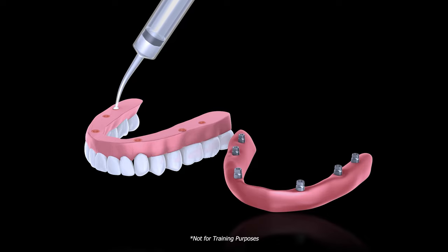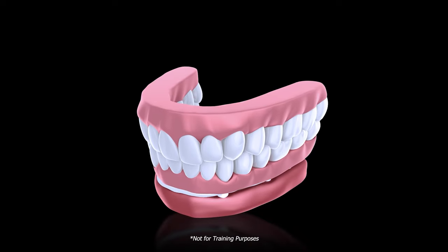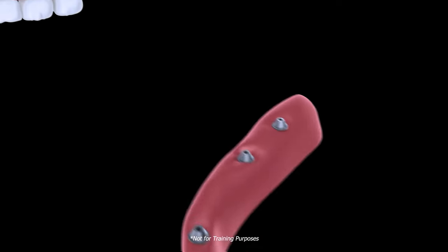Fill the wells and inject acrylic around the tie bases. A major advantage of SmartDenture Conversions is that the patient sets the occlusion. Seat the prosthesis and allow the patient to set their bite. Next, simply dislodge the prosthesis from the threaded posts.